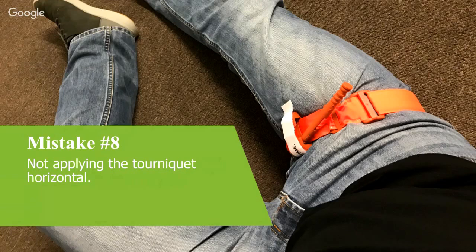So what that means is that if that tourniquet gets the opportunity to work its way loose, and the assessment was that the casualty that I spoke of earlier, it was the vibrations of flight that had made it come loose, the tourniquet is going to naturally want to migrate down on the outside. If that migrates down on the outside to a part of the limb that's a bit narrower, it's no longer tight enough to be occluding the artery. So you will be able to achieve arterial occlusion with the tourniquet as it's pictured there.